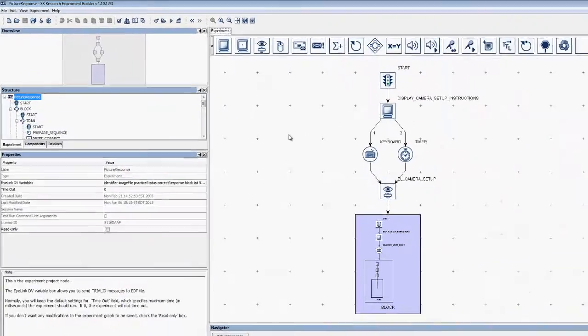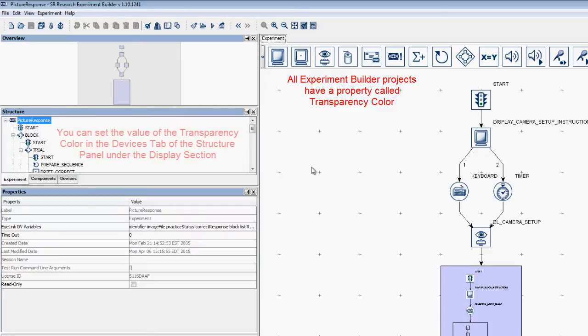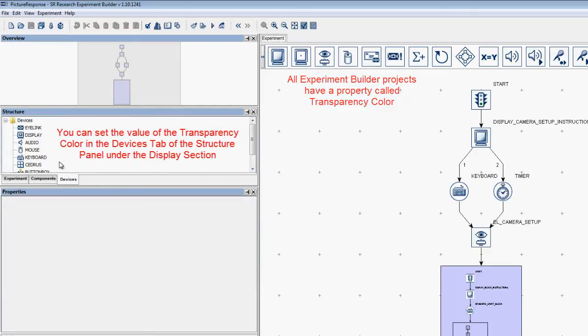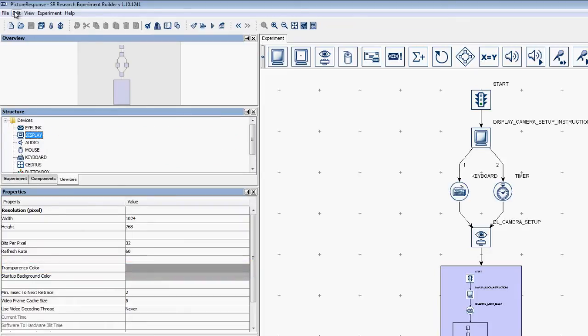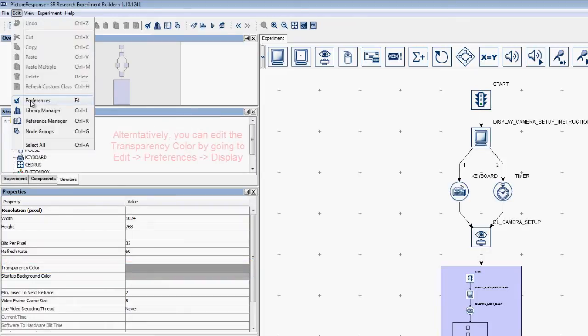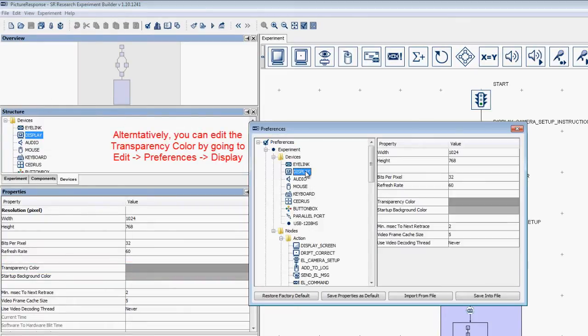All Experiment Builder projects have a property called transparency color. You can set the value of this transparency color in the Devices tab of the Structure panel under the Display section, or by going to Edit Preferences Display.